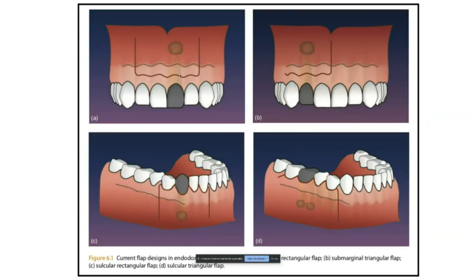Okay? Because on the tomography, on the 3D X-ray, I saw we have a little bit of bone, so I decided to make a submarginal flap for this case, okay?